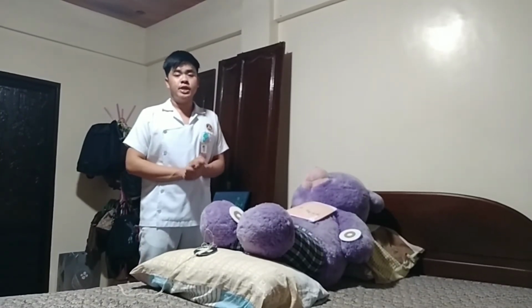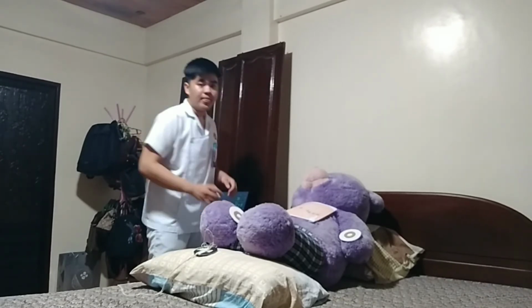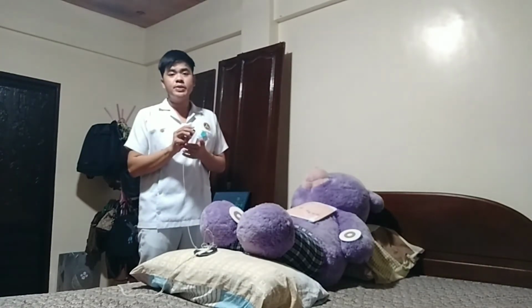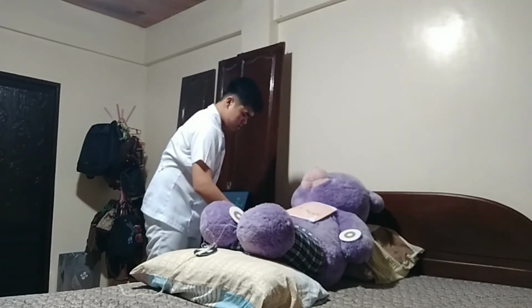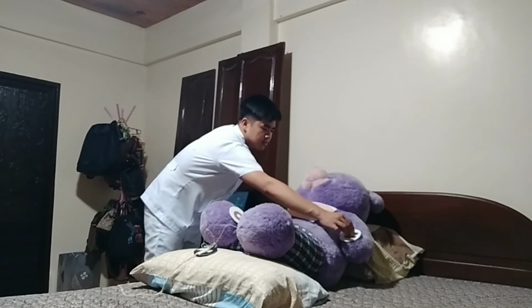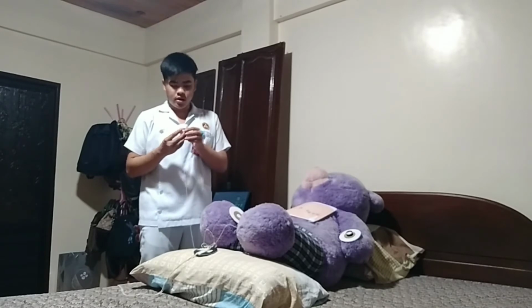So I am going to use a disposable electrode. I am going to simply remove the contact paper, and I'm going to make sure that the metal is bright and clean. For the left arm is the black color. For the right arm is the white color.